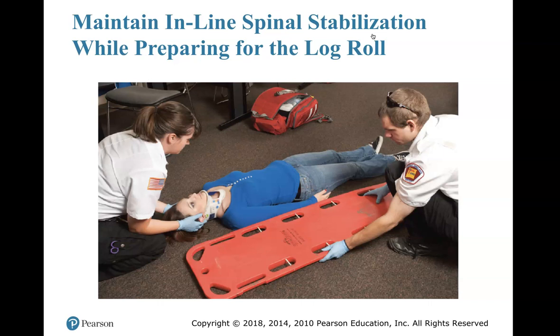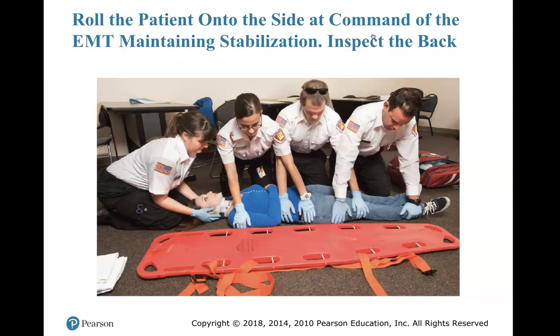Getting ready. You see this lady on the left has manual inline stabilization. Plus, they have a C collar on. Please make sure you put a C collar on first. Look, they have help. The more help you have to log roll the patient, the better, because you don't want to hurt your back either. And you want to make sure that patient gets up high enough so that you can get her on the backboard.